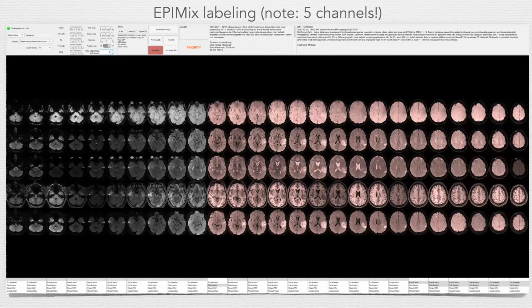And here is the labeling system I wrote, because we have read and labeled 2,000 patients, and as neuroradiologists are expensive, they're also expensive labelers. So I've written this MATLAB user interface for quickly having a single click for one slice, and we have selected sort of 6 slices, sick or healthy slices in the brain here.